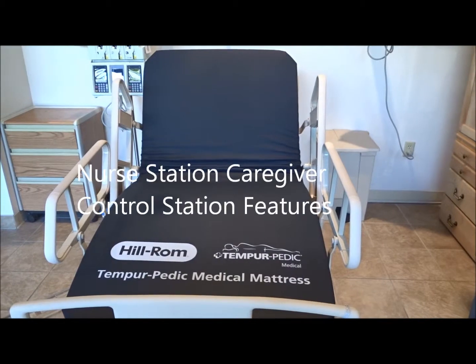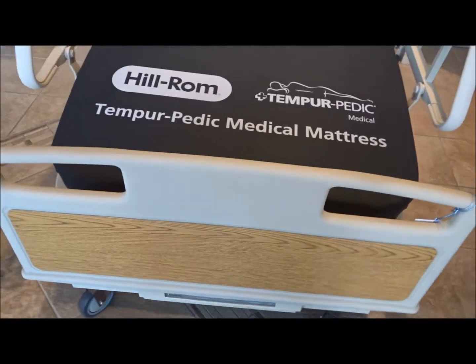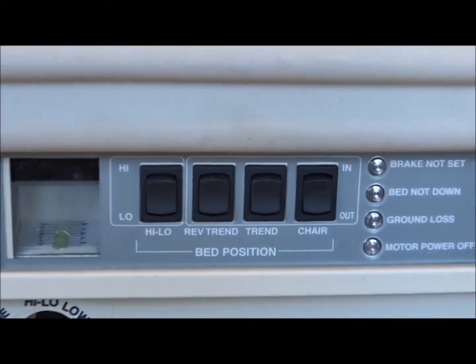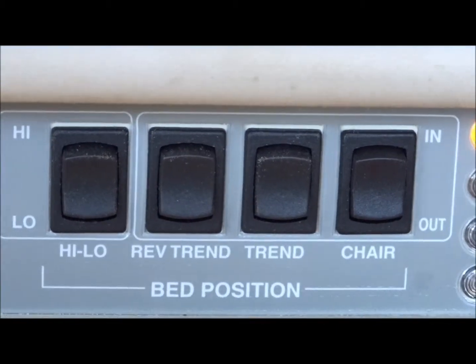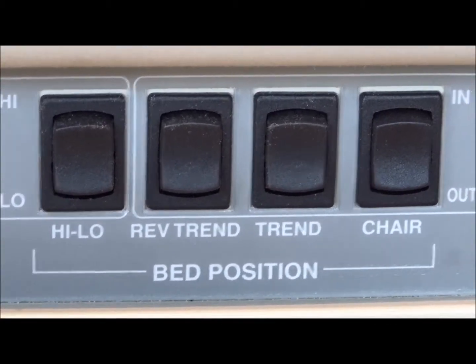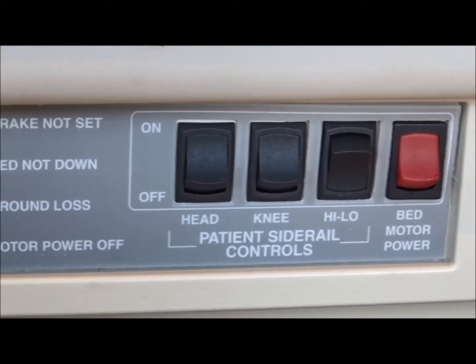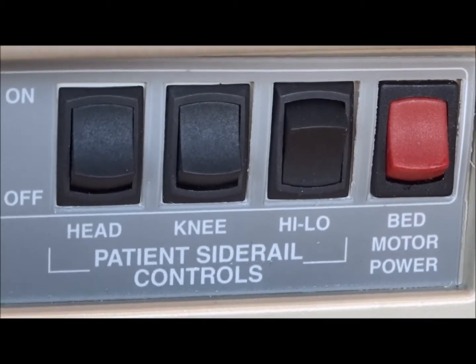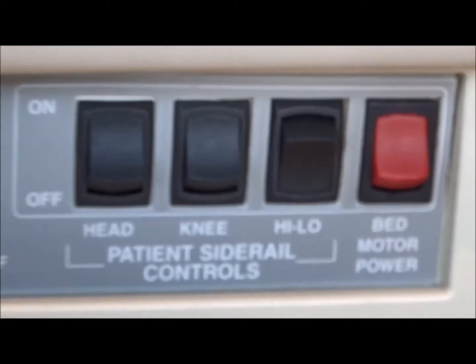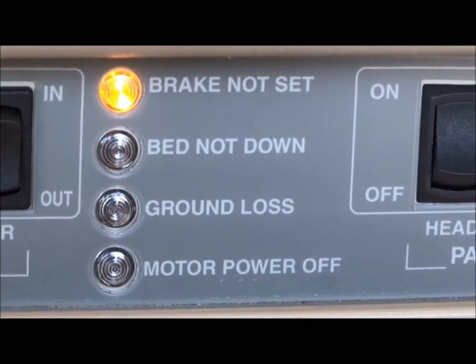The Hillrom Advanced Bed is a six-function electric bed. You have head up and down, foot up and down, the entire bed goes up and down, and you have Trendelenburg and reverse Trendelenburg. Here's the set of controls at the foot of the bed: it gives you high-low, reverse Trendelenburg, Trendelenburg, and chair position — chair in and chair out. You also have your other motor functions: head up and down, knee up and down, high-low for the bed, and the bed motor power, so you can turn the motors off and disable them.